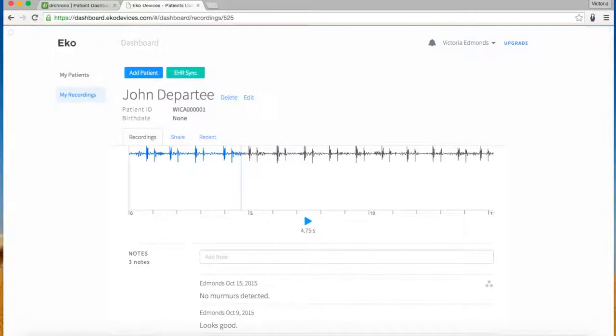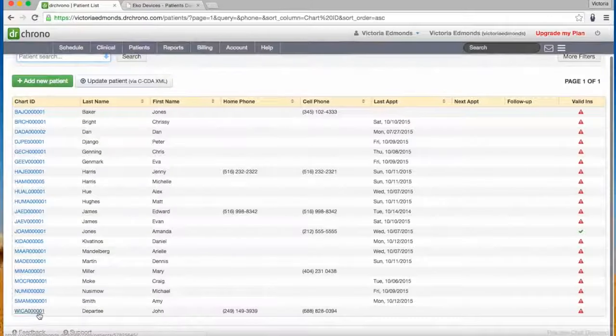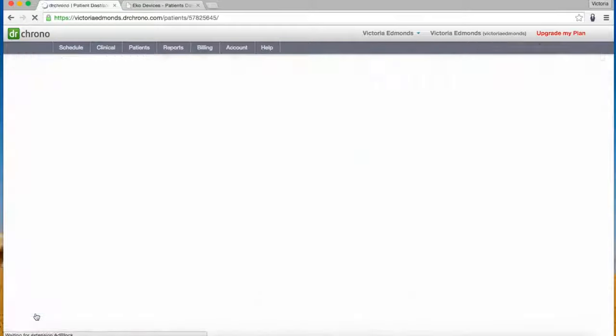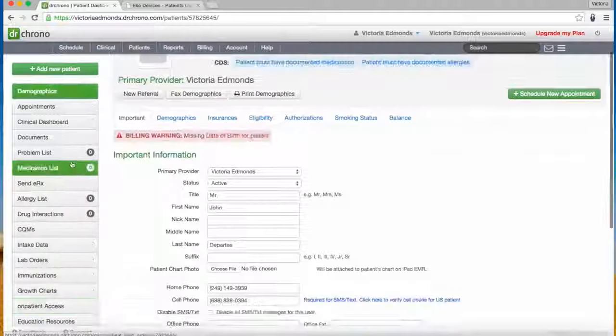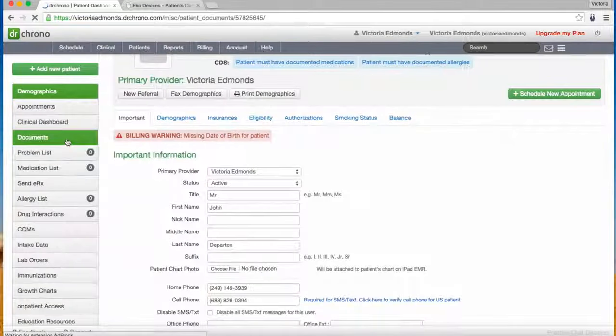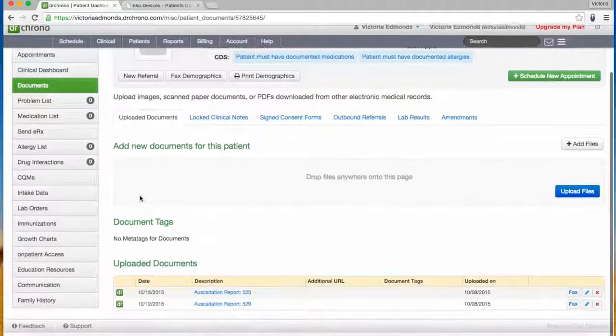Any annotations or edits made to a recording by you or other physician collaborators will update the corresponding PDF report in Dr. Chrono, so that your patient files are automatically kept current.